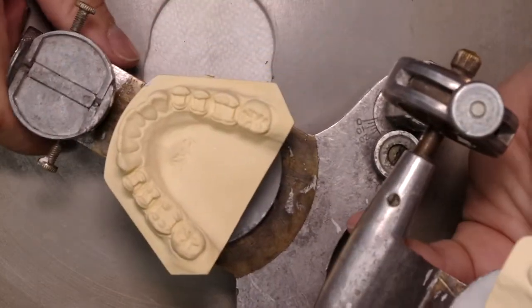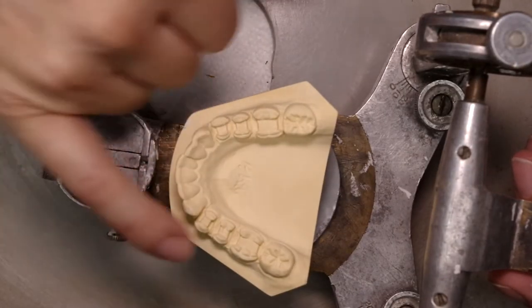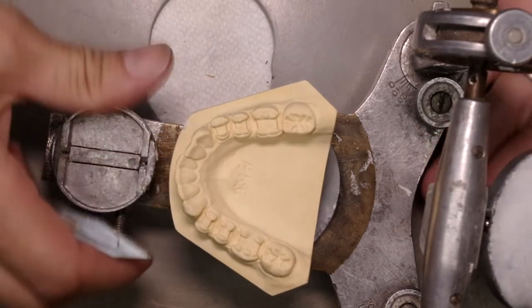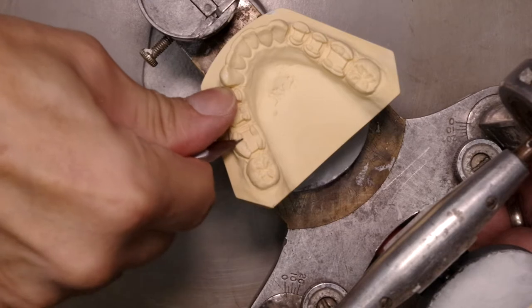We'll take a look at this model. If we see, these are prepared for occlusal onlays. We're going to take a sharp knife and we're going to take these tips off.